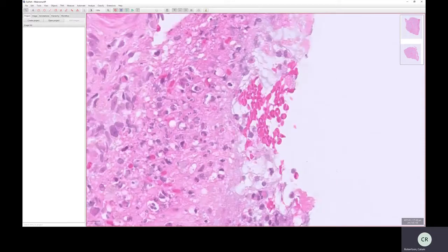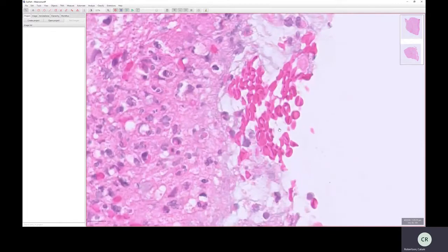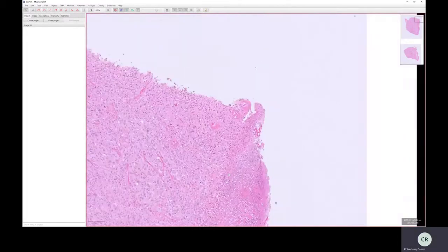And here we've got our friends, the erythrocytes, as you can tell, because these cells are just taking up eosin, and they have that concave look to them. So there's erythrocytes, and that was one of the things.